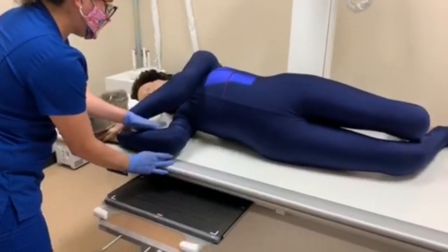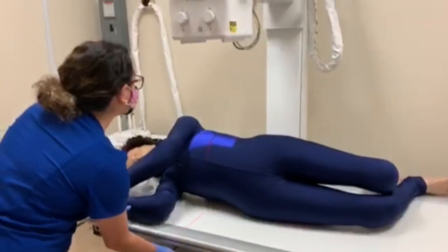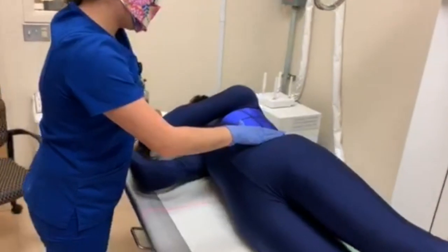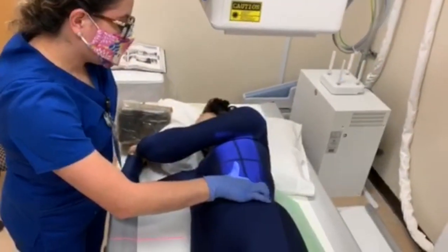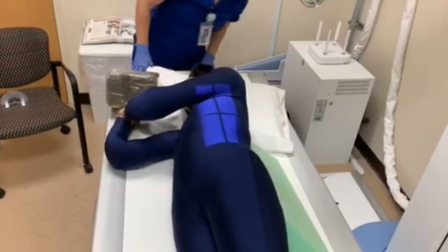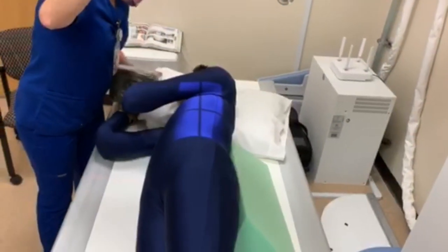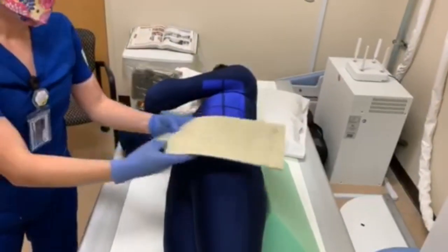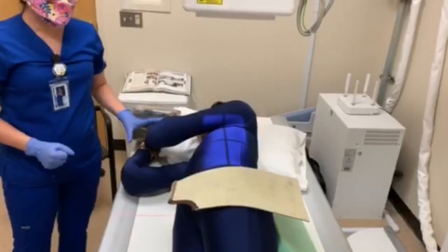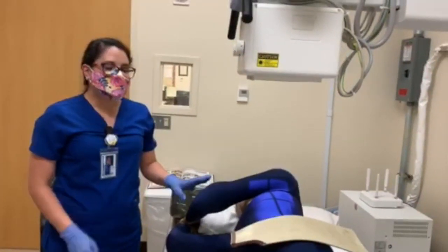I'm going to put my right marker on the right side. And we're going to collimate to just below the end of her ribs, making sure we get all of T-spine, making sure we have enough light to get the vertebrae. We're going to shield any tissue that doesn't need to be exposed. The KVP is still the same, 90 to 95, and we're going to expose on full expiration.